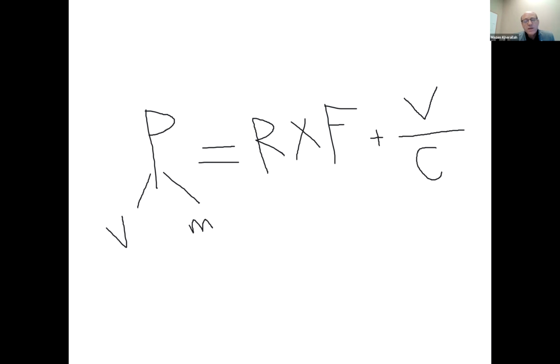Now let's just take a scenario of how this is changed. Okay. In volume controlled mode of ventilation, that means that we are controlling the volume here. So let's say that I have a mode where I need to deliver 500 ml of tidal volume. This is the control, it's fixed. So this is the independent variable. Now, the equation of motion has to be equal on both sides. In order to deliver the 500 ml, the machine will utilize pressure.